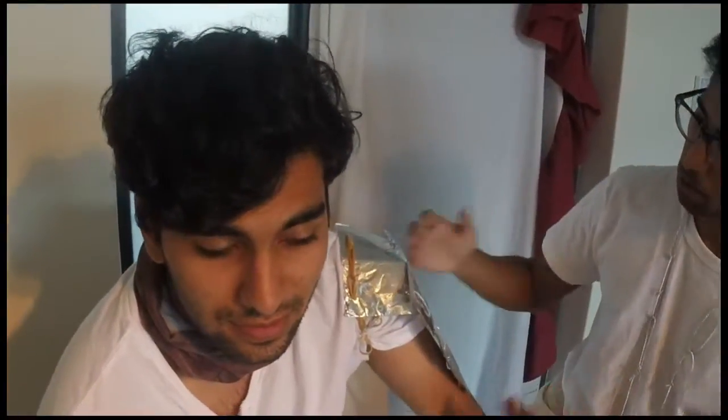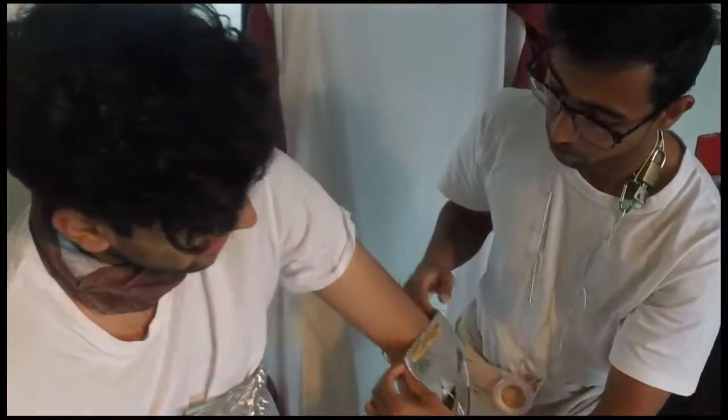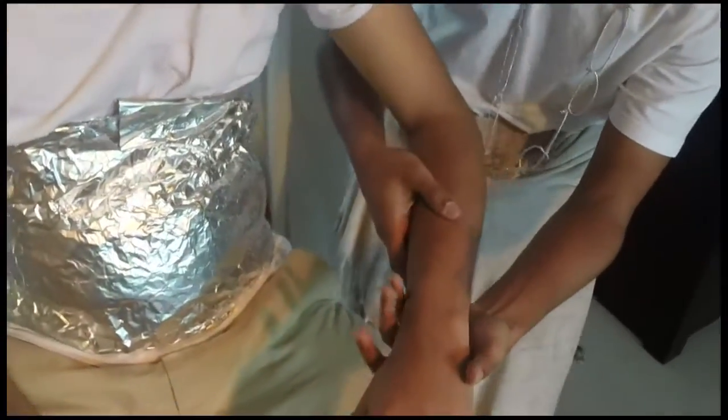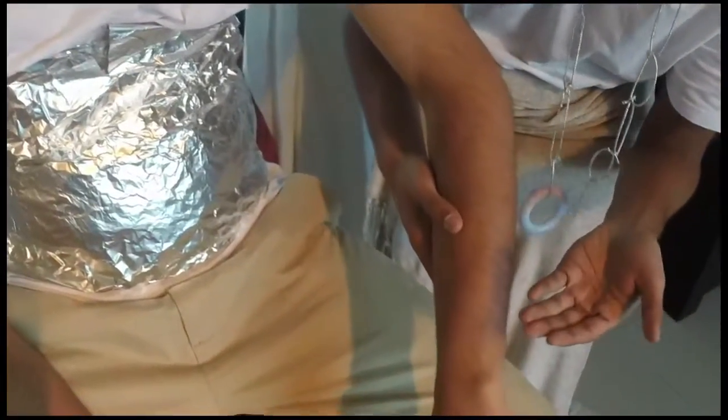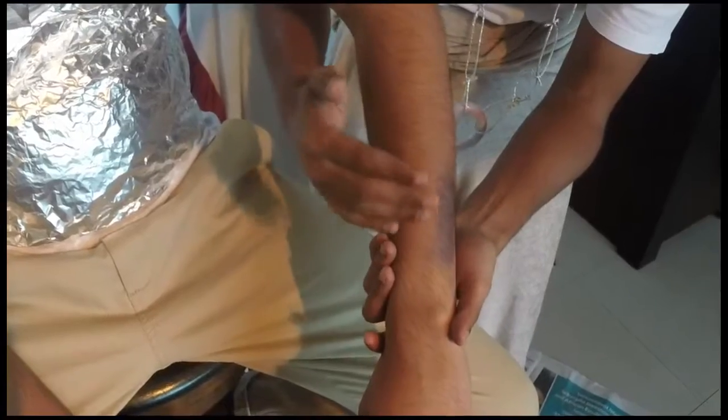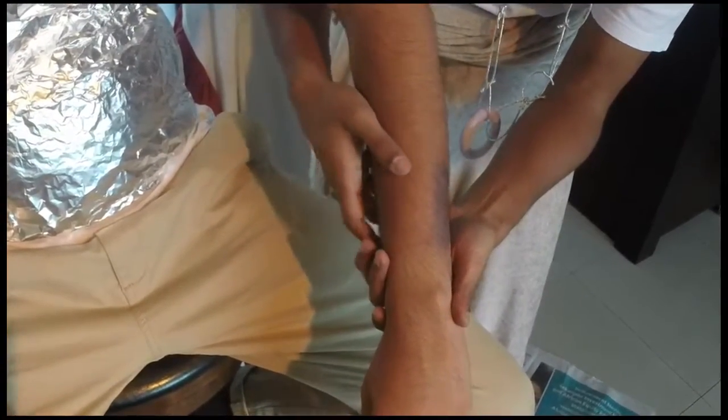So, as with any examination, it's essential that one completely exposes the affected limb that should be examined. We begin by looking at the limb, looking for any swelling, any obvious deformities, signs of muscle wasting, color changes, and here we can observe a bruise over the distal ulnar aspect of the forearm.